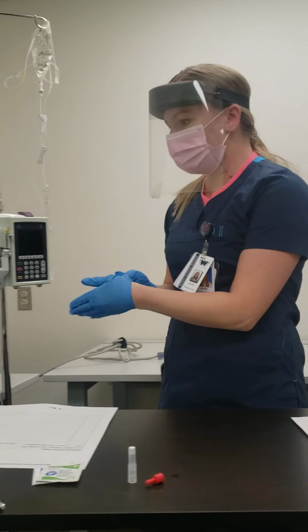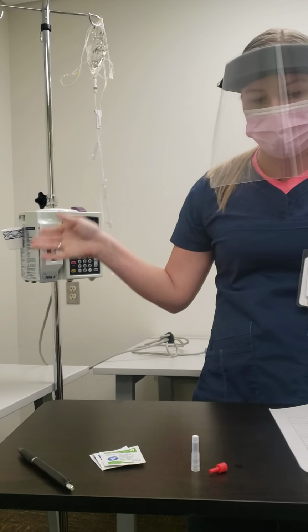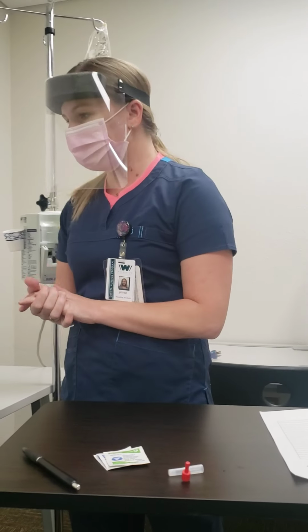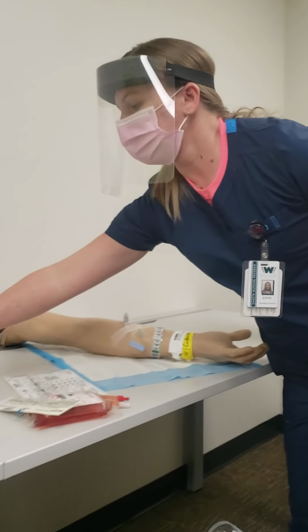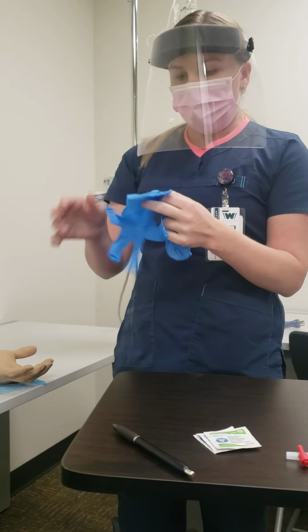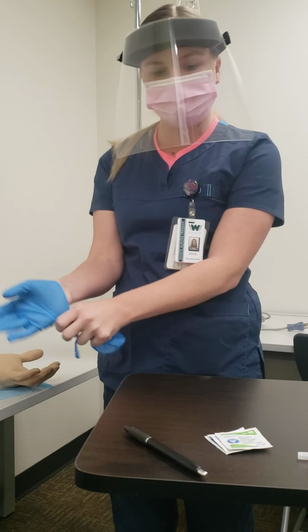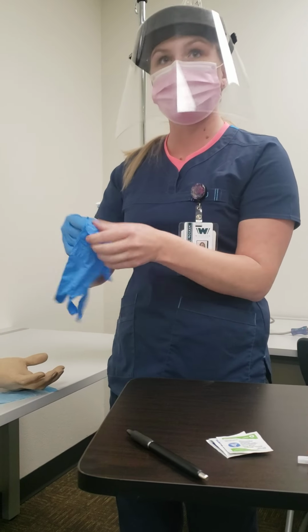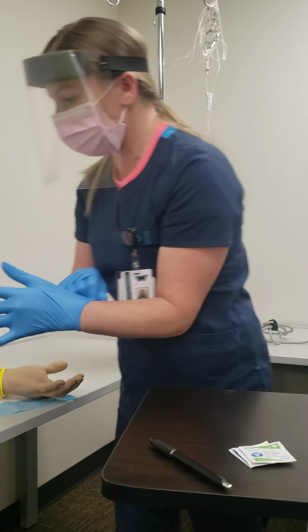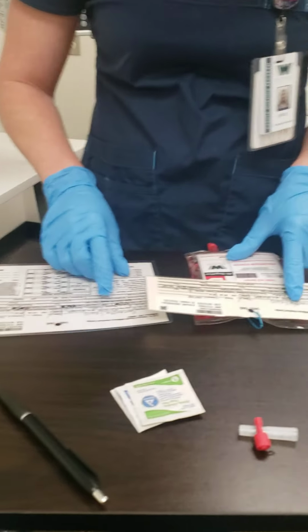Okay, so now that that's done, I'm going to change my gloves. Let her know that I am going to the blood bank to get the blood, and I'll be right back to start that infusion. So, okay, I'm in the blood bank, and I'm with my med tech, and I'm just going to verify that the blood matches up to Samantha, and the blood is compatible. So I'm with the med tech, and I have Samantha Lewis.